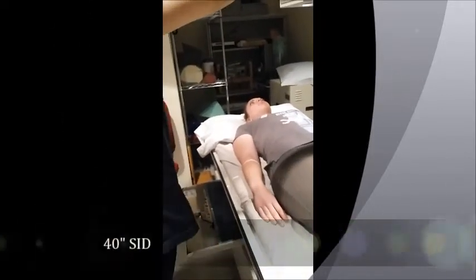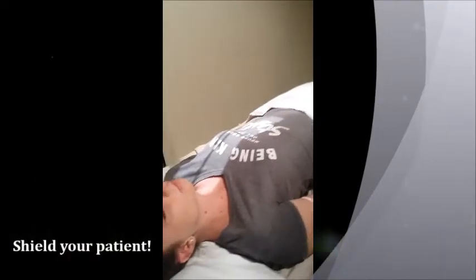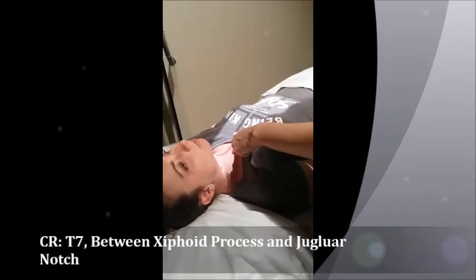We're also going to shield her. Your centering point for an AP T-spine is at T7, which is midway between the jugular notch and xiphoid process. Another way, if you have limited visibility or something, you can kind of go off of their nipple line — depends on what you like to use.